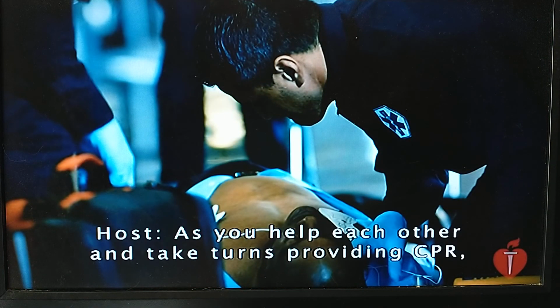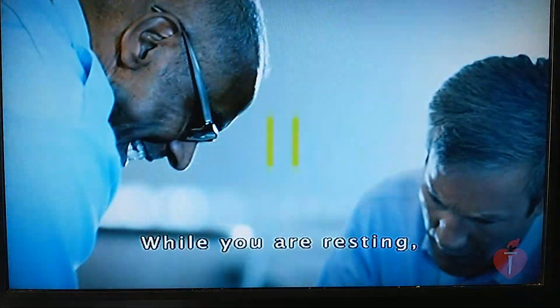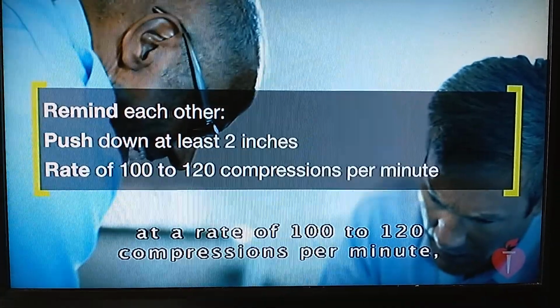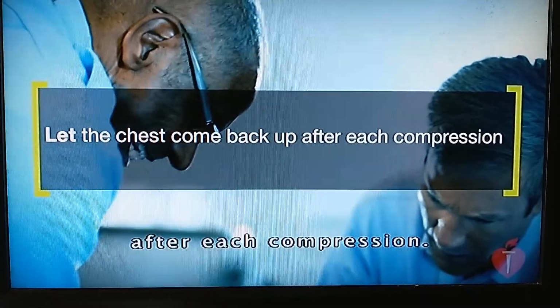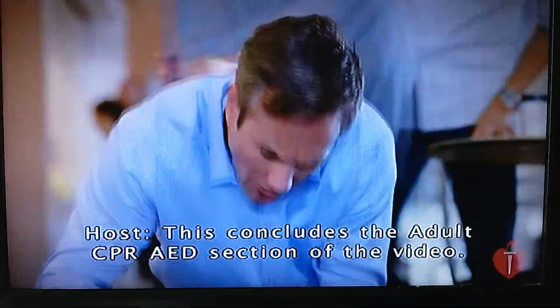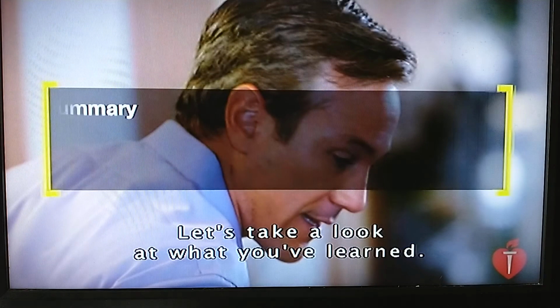As you help each other and take turns providing CPR, it's important to give each other feedback. While you are resting, remind the other rescuer to push down at least 2 inches at a rate of 100 to 120 compressions per minute, and to let the chest come back up to its normal position after each compression. This concludes the adult CPR AED section of the video. Let's take a look at what you've learned.